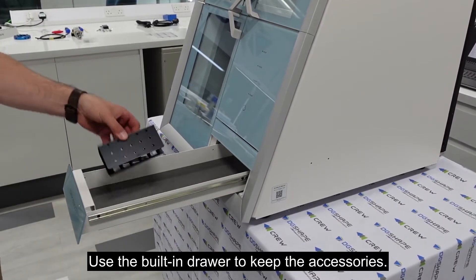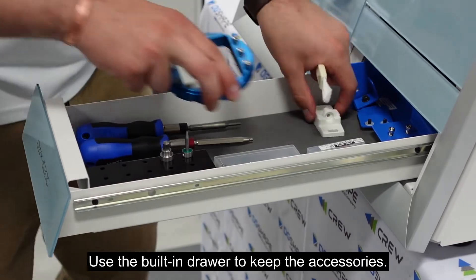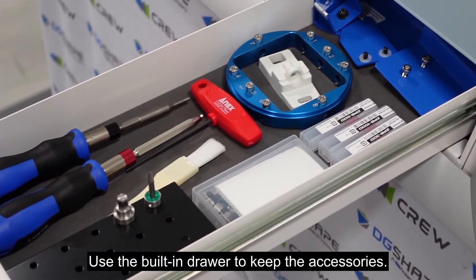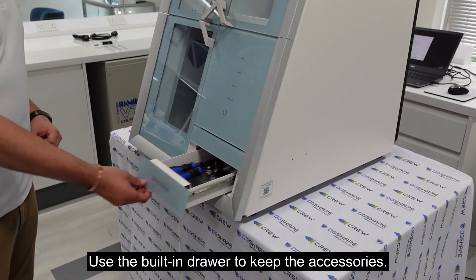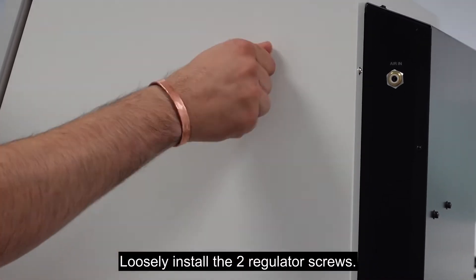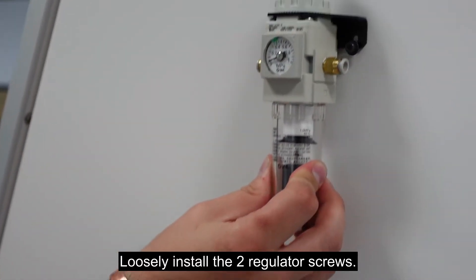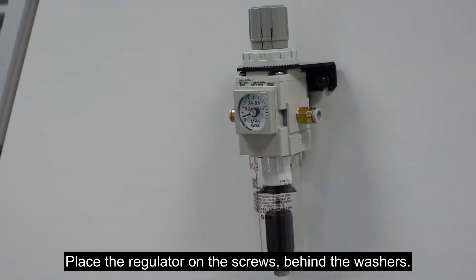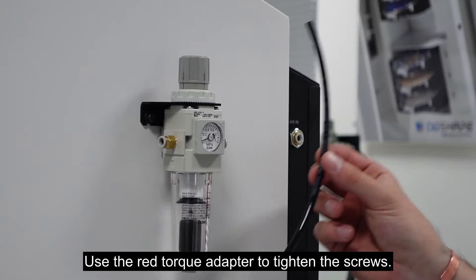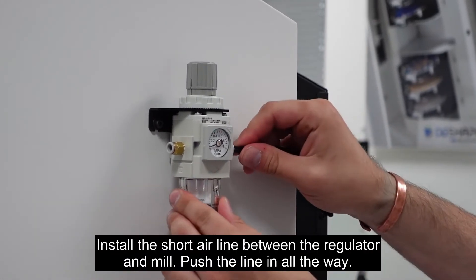Use the built-in drawer to keep the accessories. Loosely install the two regulator screws. Place the regulator on the screws behind the washers. Use the red torque adapter to tighten the screws. Install the short air line between the regulator and the mill.